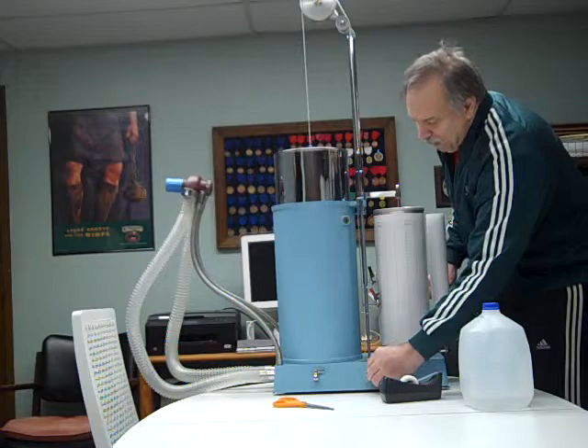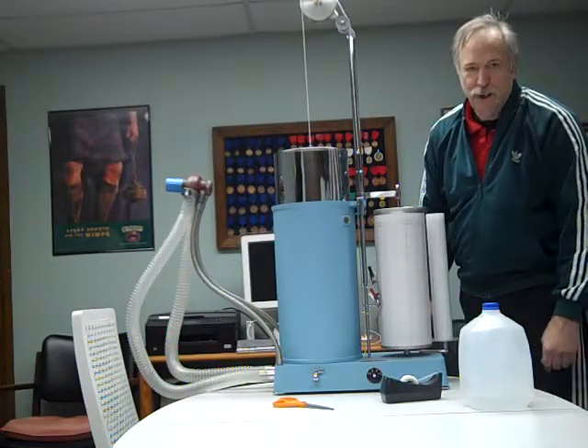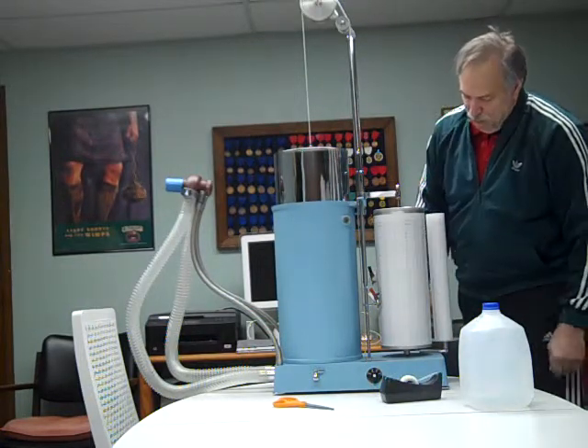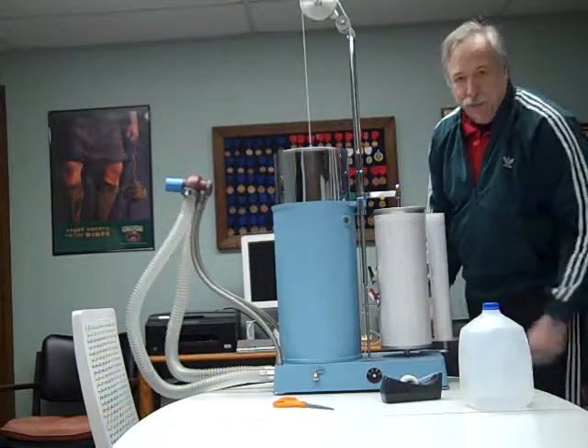Now the kymograph has three different speeds. The speeds mainly are used to save paper. Right now it's moving at a very slow speed. The next speed over, you can see the bell may be moving a little faster going around. And finally, the top speed.